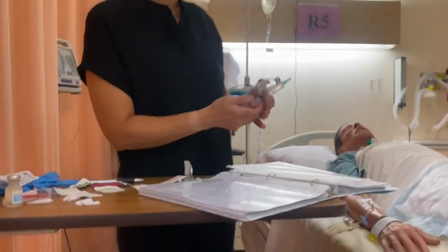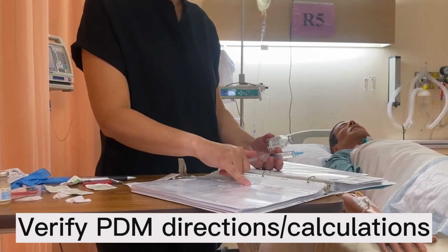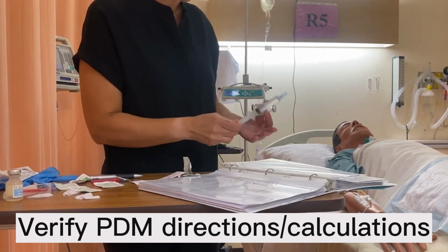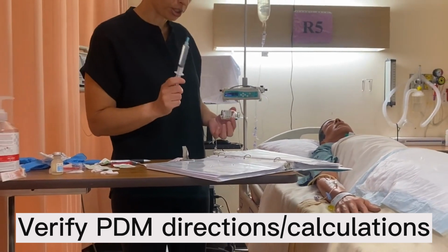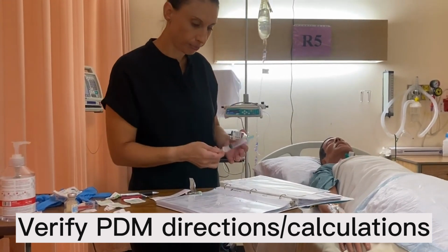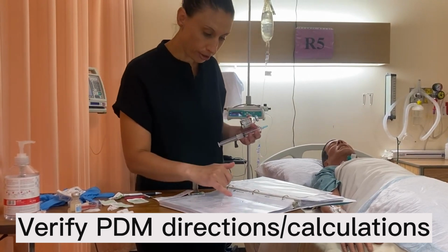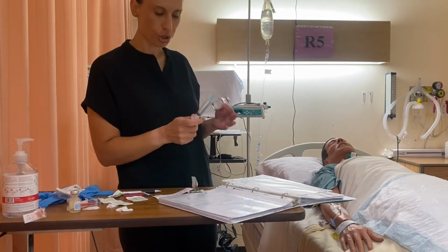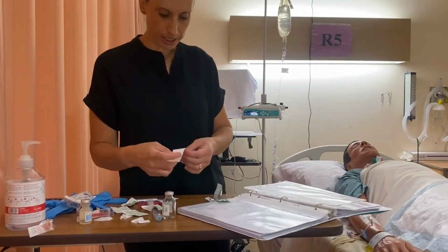I'm also gonna take a look at my syringe and my PDM and make sure that I have reconstituted this correctly. It was a 500 milligram vial, so I needed 10 mls of sterile water. And so that gave me 50 milligrams per ml, and I needed the whole dosage for my 500 milligrams, so that's what I have in my syringe. I have 10 mls in here, and that's all I need to do. I do not need to dilute it any farther because I can give it undiluted over 3 to 5 minutes. That's under the IV push criteria there. Okay, so I'm gonna affix my label.